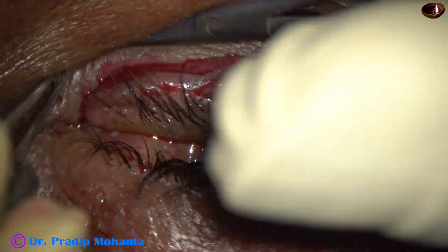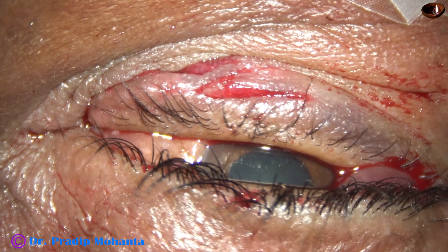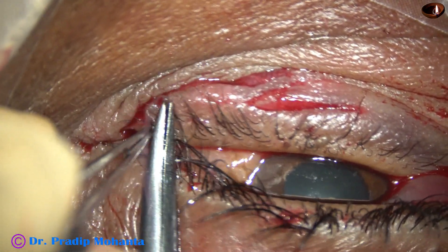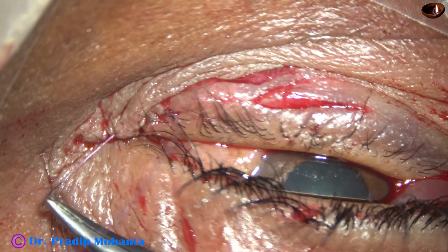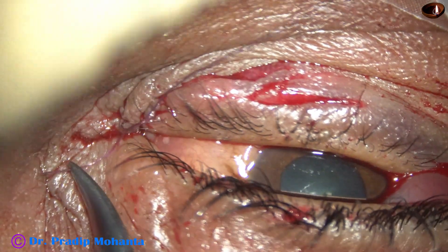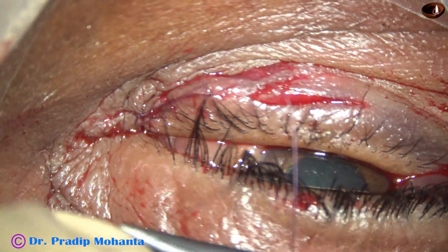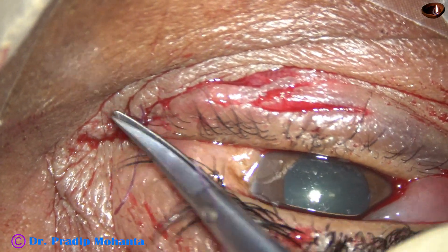And now, the eyelid interrupted suture is taken, so that the two raw surfaces are opposed to each other very nicely. And this has been a two-in-one suture.